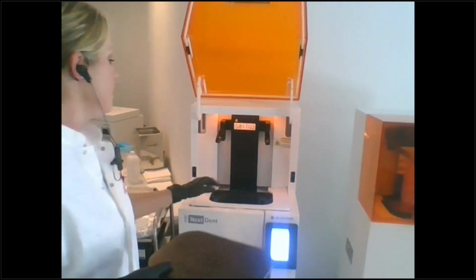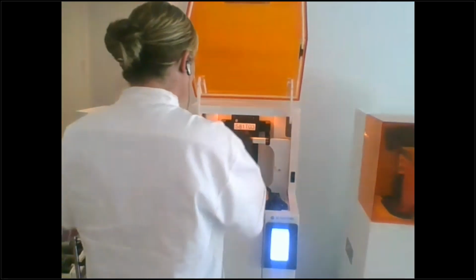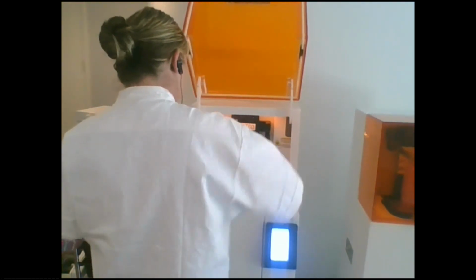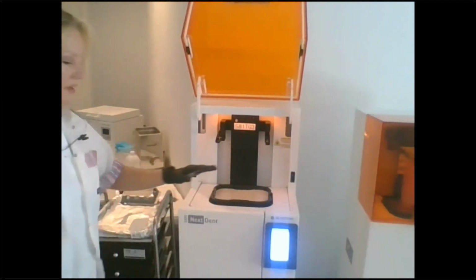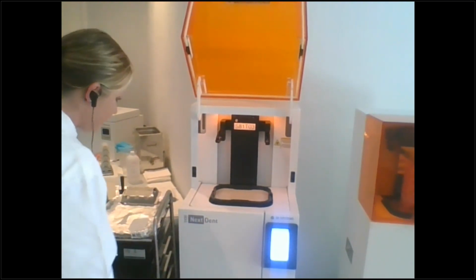No purging, no cleaning. You just put that resin tray in there and make sure it's right where it's supposed to be. It only fits in one way. You're going to put your tension arms down. There's a little click that happens.